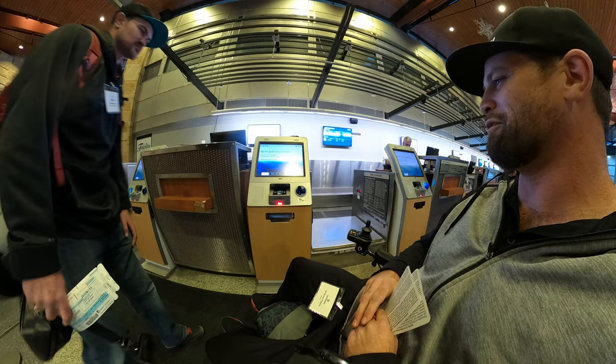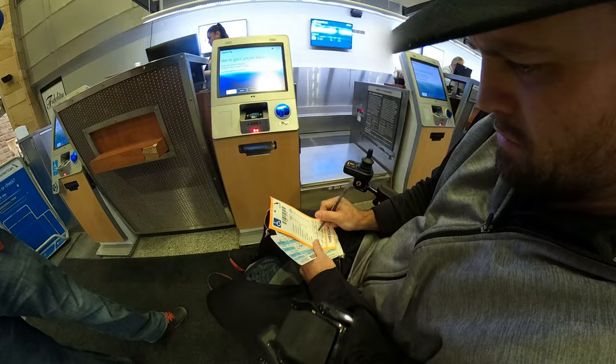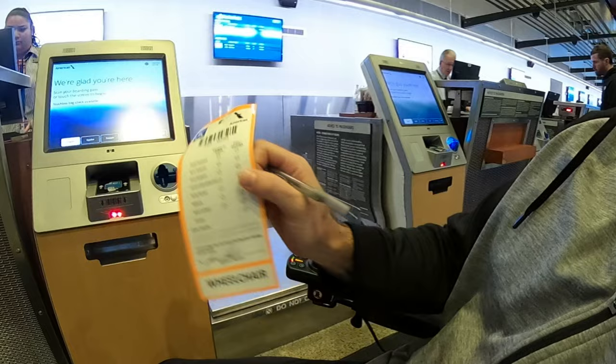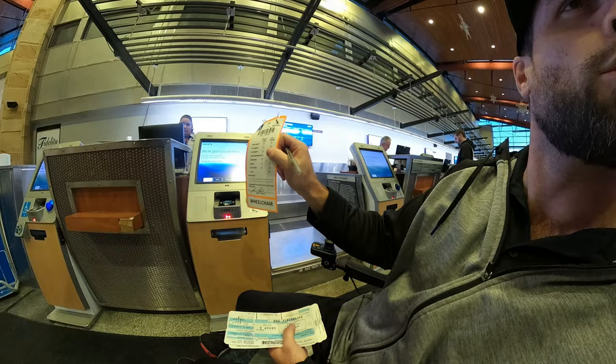Have you signed here at the bottom? Absolutely. So what we have here is a gate tag. I get a copy, and this is going to go on the chair as well. When I get back, between flights, they're going to bring me the chair up at the gate so I can get to my connecting flight. So this is so that I don't get lost. This is going to go in the same place as a stroller would.